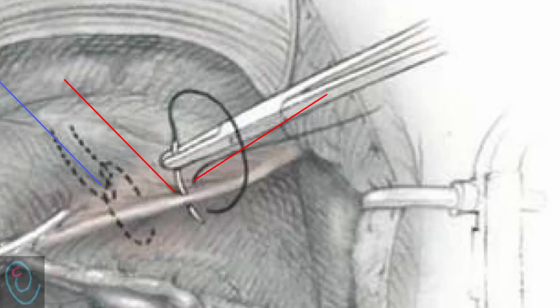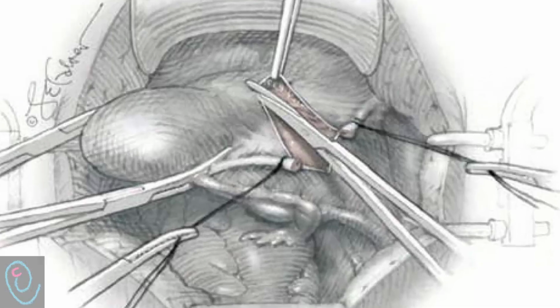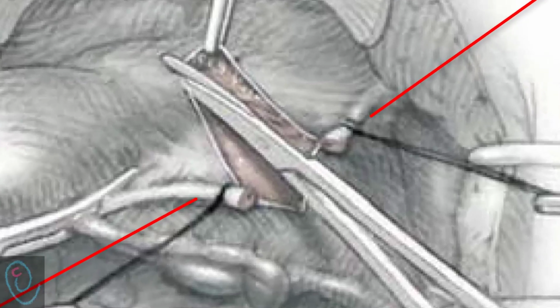After that, the round ligament is divided between the two sutures, and the incision line is directed deeply about 1 or 2 cm of the broad ligament. Step 5. Anterior broad ligament leaf. The round ligament sutures are placed on tension, and the incision is made in the anterior leaf of the broad ligament. Scissors are introduced between the anterior leaf and the underlying loose connective tissue.